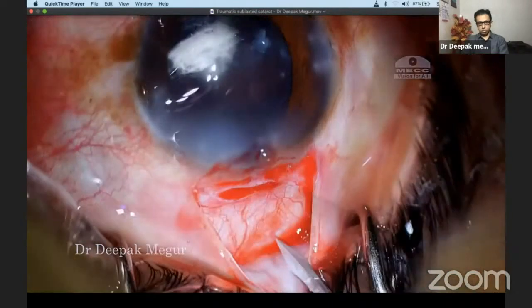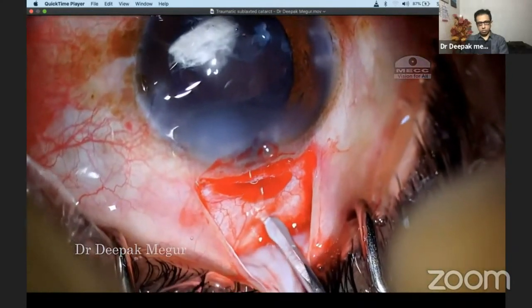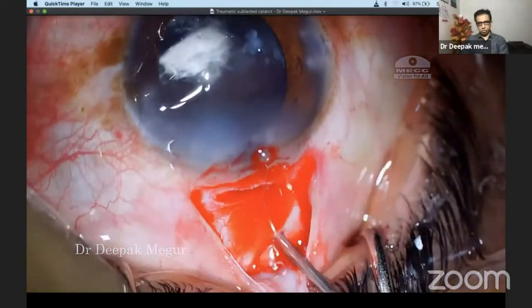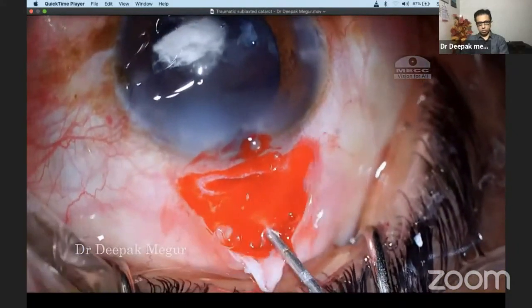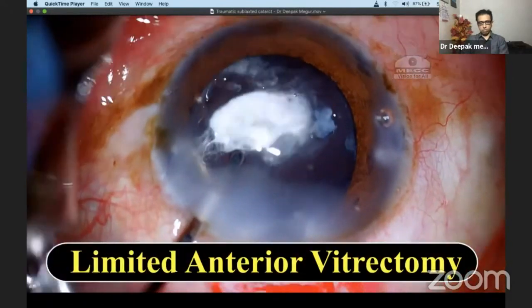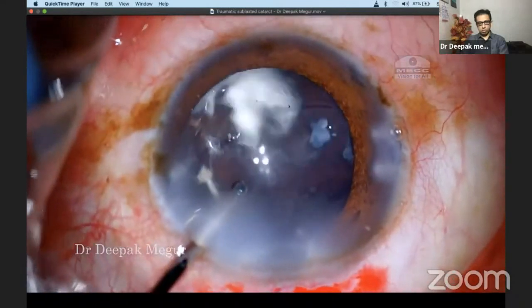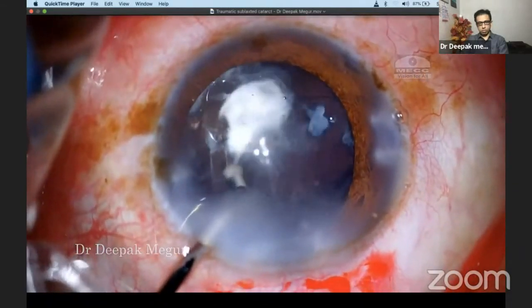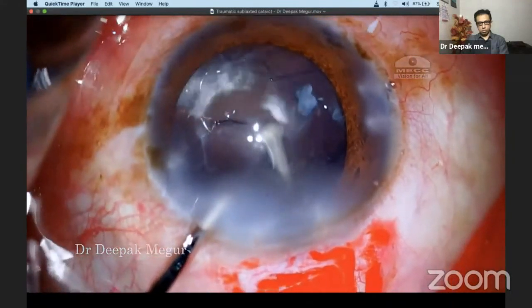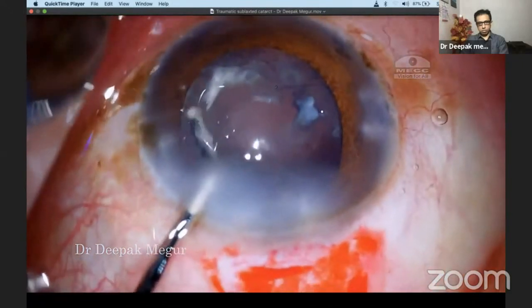Three millimeters from the limbus, I make a sclerotomy using an MVR blade just behind my scleral tunnel incision. Using my 23G cutter and infusion through the anterior chamber paracentesis, I proceed to do a limited anterior vitrectomy. Care is taken that I remove all the vitreous adjacent to the area of the zonular dehiscence, and I'm cautious not to damage the posterior capsule — just enough to ensure it doesn't prolapse through the zonular dehiscence.